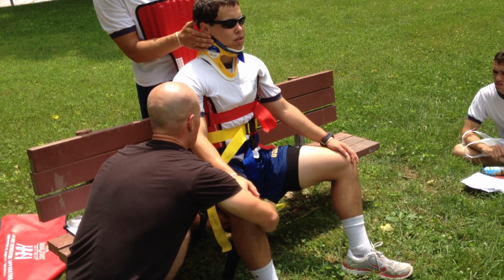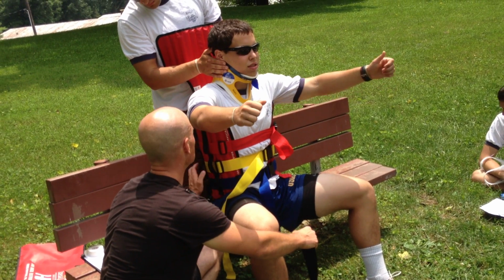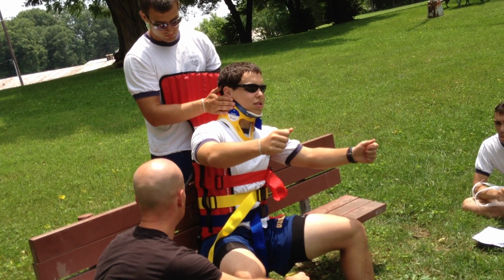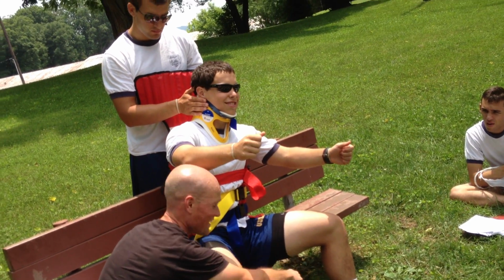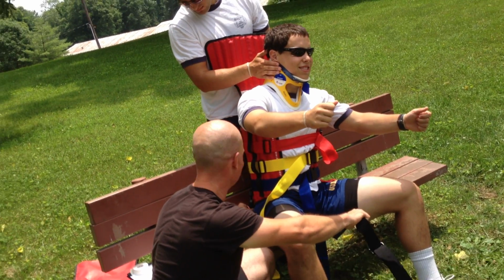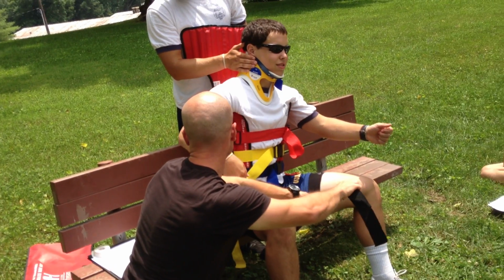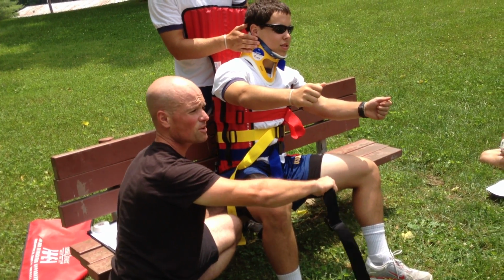And if my patient can help a little bit, sir, grab your steering wheel again, and I want you to very gently lean to the left, and you can help us a little. That's all I need, thank you. And now I use a flossing motion to get that right into the middle. You gotta pay for that in some places. And before I buckle the strap, I pull it all the way forward so that there's no tension behind the butt cheek. That's very important.